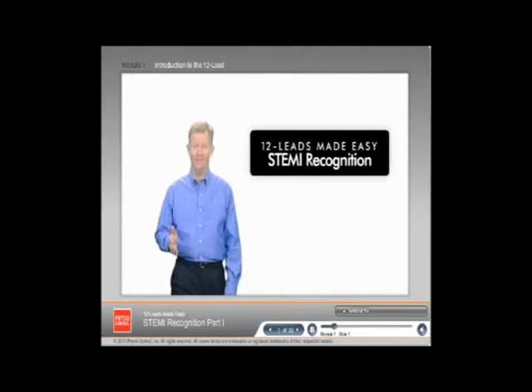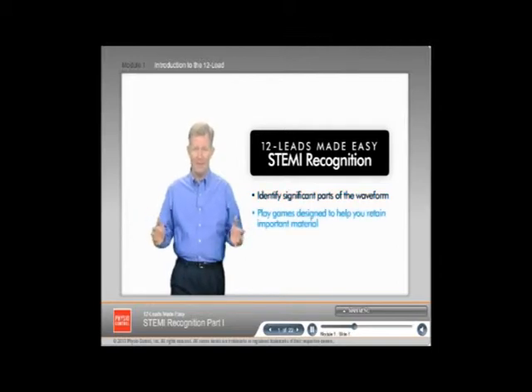I really think you're going to like it. You'll find this to be a very interactive program. Instead of just sitting and looking at a screen, you will identify significant parts of the waveform, play games designed to help you retain important material, and of course, you'll be interpreting lots of 12 leads.